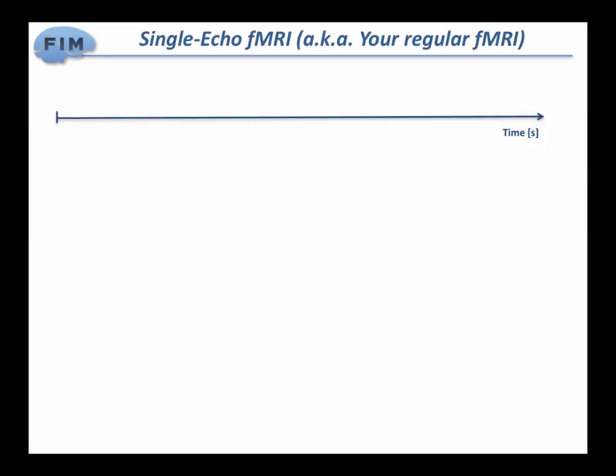Okay, so what is multi-echo? Let's think of what our regular single echo data is. In an experiment, we collect data over time. In fMRI, we're interested in fluctuations of the signal over time. And we set a TR, 1-2 seconds, depending on our experiment. Within that TR, we acquire a volume of data every TR, and we acquire volumes of data in terms of slices.